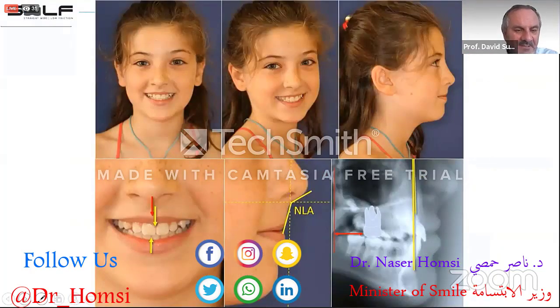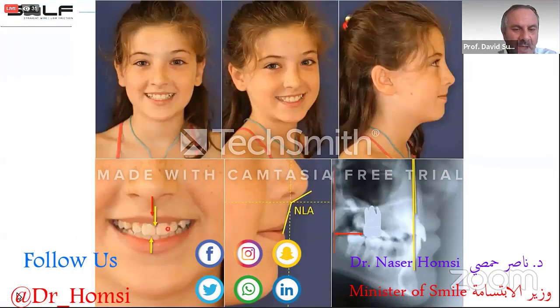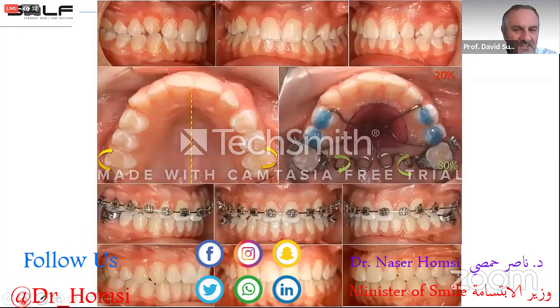Another patient, a very simple treatment, maxillary dental class 2, very simple. Okay, what is the problem of this patient? The shift of the upper midline to the left. Very simple. The problem is this.